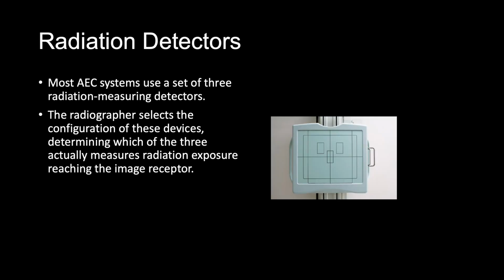So here's the upright bucky unit that I was talking about. And you can see the arrangement of the 3 automatic exposure control detectors.